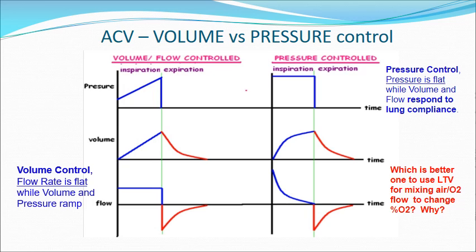And that's when you should have a huge spike in flow, which is what we see. Then gradually the flow rate will diminish as the pressure inside the lungs reaches the same pressure as that applied by the ventilator. And as the flow decreases, because the volume is the integration of the flow, you will also see that the growth of the volume starts to taper off.